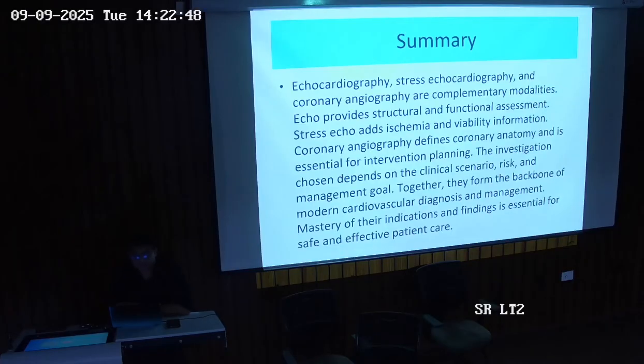Echo provides structural and functional assessment, then stress echo adds the ischemia and viability information, and coronary angiography exactly defines the coronary anatomy and is essential for intervention planning. So the investigation depends on the clinical scenario, risk, age, and management goal. Together they form the backbone of modern cardiovascular diagnosis and management. So mastery of their indications and findings is essential for the safe and effective management of patients.